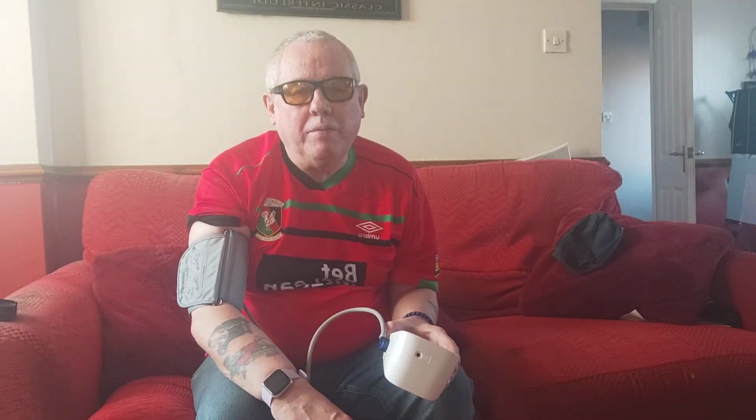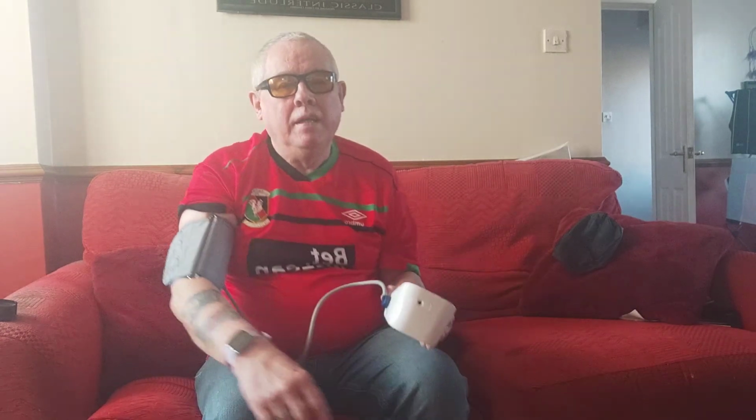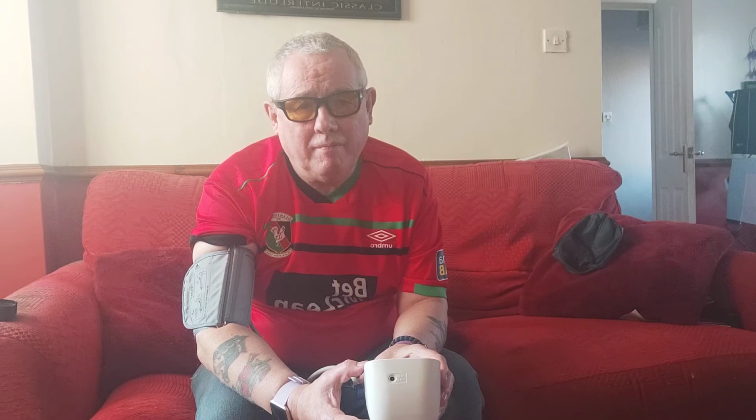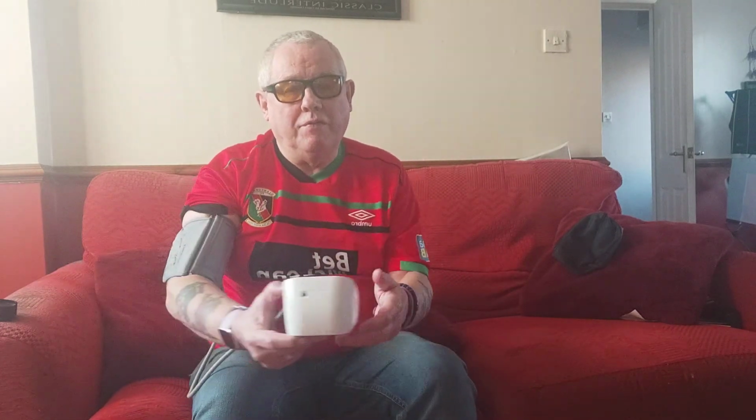So here we go. We'll take my first reading now. By the way, one thing whenever you're taking your blood pressure, and this is a fact: if you lie in bed with your legs crossed like that, or if you're sitting with your legs crossed like that, believe it or not, that is not good for your blood flow. That actually decreases your blood flow. And if you're taking your blood pressure with your legs crossed, it actually would put it up a bit, not much, but it will put it up a bit. So if you're taking your blood pressure, have your legs like so, don't have them crossed, right?